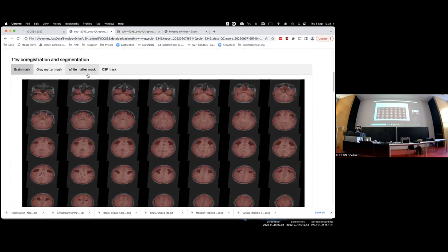And here we already see, as I told you, he has an artificial hole, don't worry about him. And here now, looking at this picture, oh my goodness, something strange. And then if you look at these masks, you also see that this masking is not working. With regard to the hole, it's still working quite okay-ish, but at the end, this is not a proper full brain mask that you get, because around the hole it's doing strange things, right? It's detecting this brain matter just wrongly. So at least it's around, but it also detects part of the hole, which is just wrong and can then lead to issues during the normalization. So it's somewhat detecting, but it's not a proper brain mask that you're ending up with.